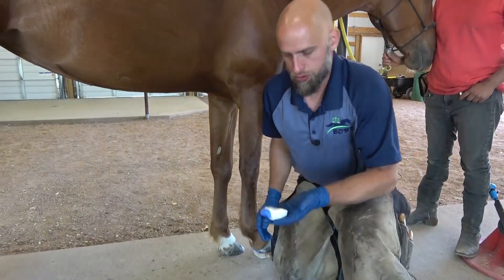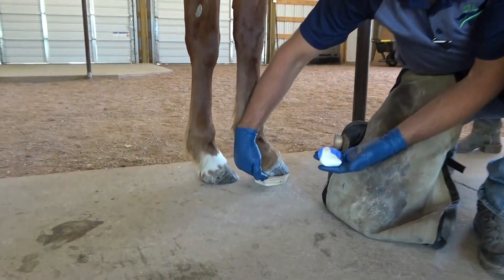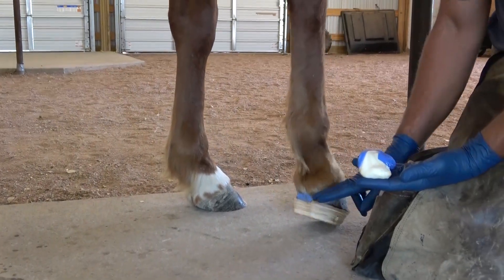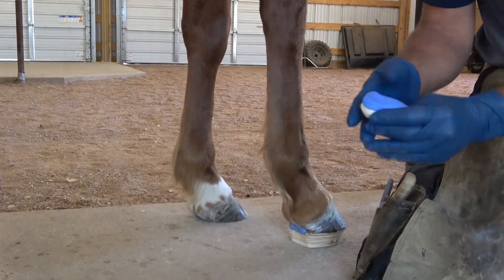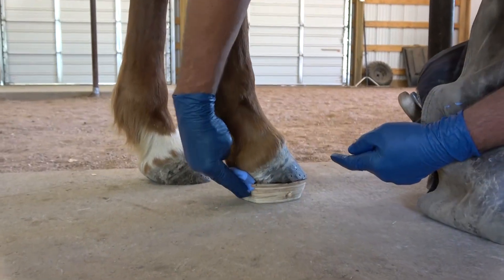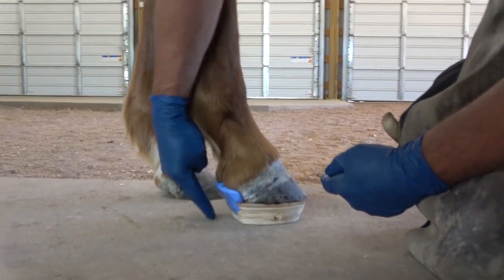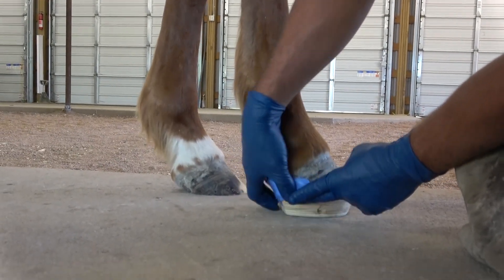What we're going to do next is mix up some Dim and create a Dim dam for the back of the foot. What we've learned over the years of casting is that we want to follow the contour of the heels and the heel bulb, and also bring some of the Dim dam around the back of the heels on both sides so we don't pinch the heels. I'm going to start by placing some material in the back here, following the contour of the heels. It's okay if it gets a little high — we can always come back and trim it. Then I'm going to create a Dim dam through the heel here.